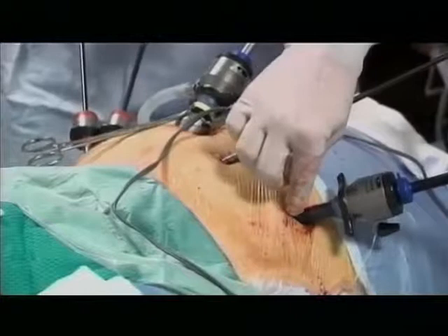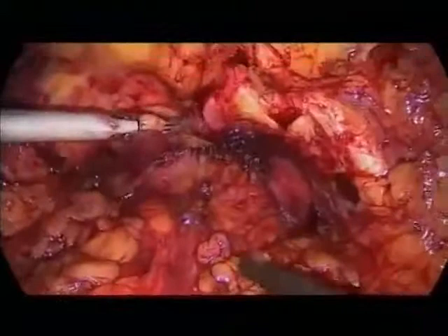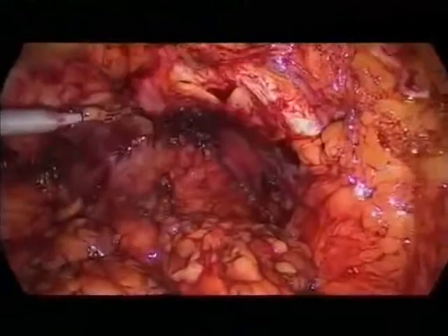So can we have the endoscopic? Oh, yes. Okay, we see the view inside of the patient. This is the symphysis here. This is the pubic arc. And we have used this very typical balloon trocar. I think it's extremely helpful, and it helps you to develop the extraperitoneal space very quickly. We also use this trocar when we do primary hernia repair. I think it's very easy and not so expensive.